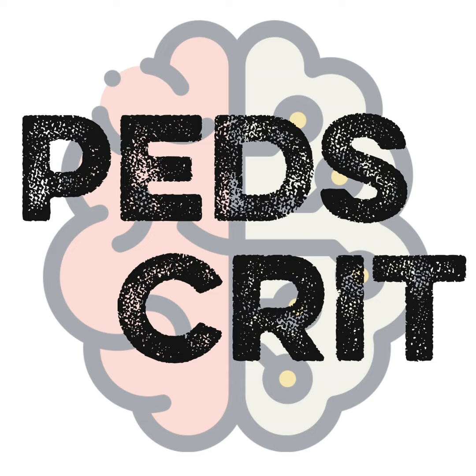32 plus or minus 2 is kind of, I just figure being precise about these things sometimes gets a little hard to operationalize on a breath-to-breath basis, particularly with fuzzy modes like PRVC and pressure control. So 32 plus or minus 2, okay? As long as you're staying below that, I will do what's called an escalating PEEP trial, where based on your initial x-ray and how difficult you were to bag, I'll guesstimate an initial starting PEEP.